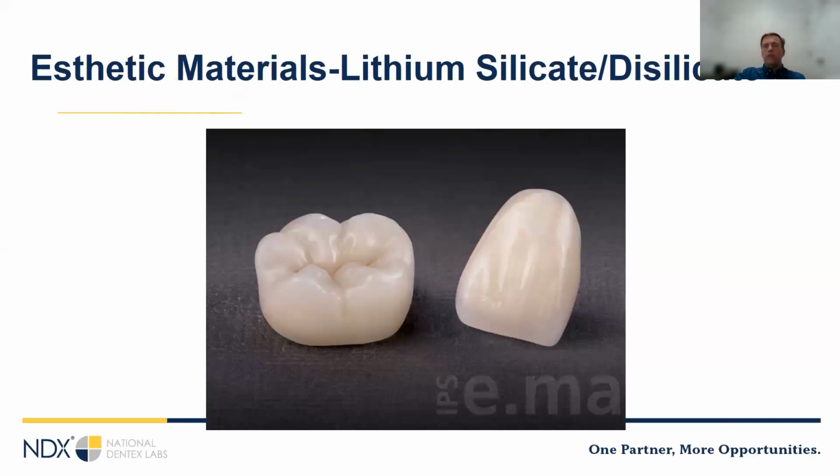Lithium silicate or disilicate restorations are good for premolars and anteriors. I'd say they're the restoration of choice today for bonded restorations, veneers and inlays and onlays, because they have a nice combination of strength, aesthetics, and predictable bonding procedure. They look great as monolithics and come in a variety of different translucencies, and they can be micro-layered for even enhanced aesthetics.